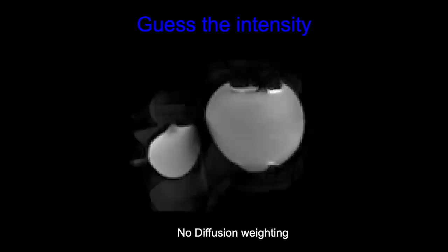Okay, so now let's get a visual of this in real life. We're going to play a little game of guess the intensity. Here I've got two containers. The small one has a viscous polymer and water solution in it, and the large ball has distilled water. These are both at room temperature. This is what the image looks like with no diffusion weighting. They're about the same signal intensity, right? Now we're going to do this diffusion weighting.